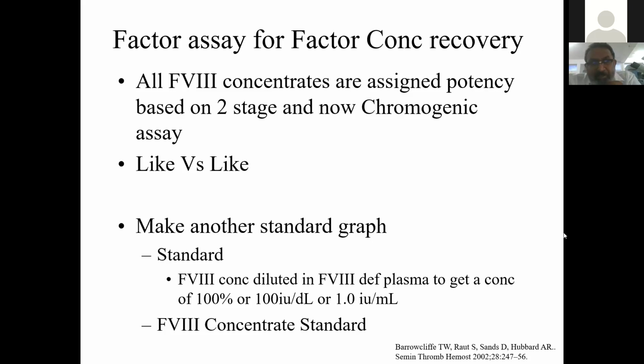Then somebody came out with a brilliant idea. That is Trevor Barrowcliff. He was working as the head of the National Institute of Biological Standards and Control near London, which produces all the international standards. And he said that there is something called the like versus like principle. Can we adapt that? So the like versus like is like this.